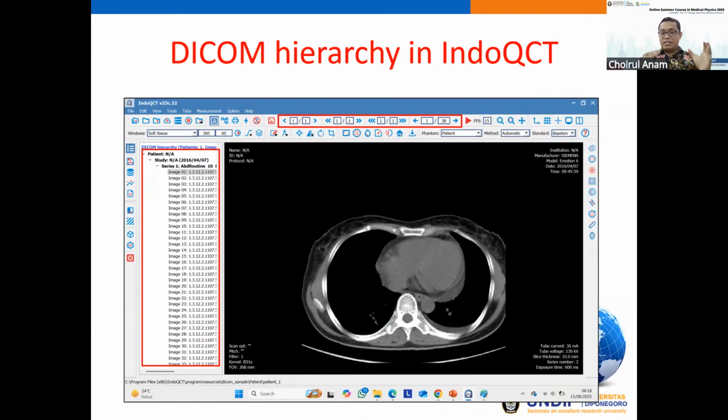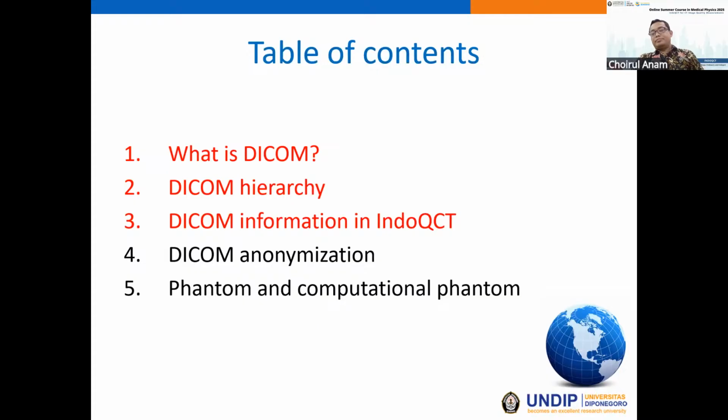So in the IndoQCT, we have the tool for moving from one patient, one study, one series, one slice to another one. And then sometimes the DICOM information is important.